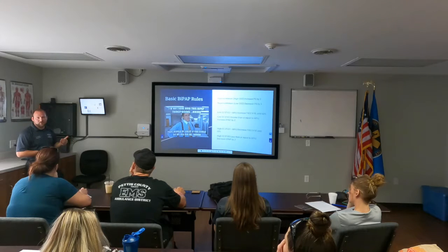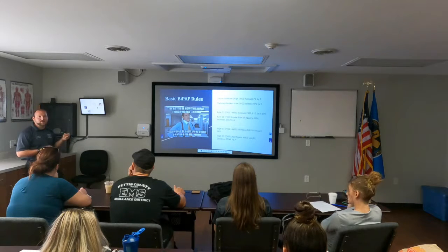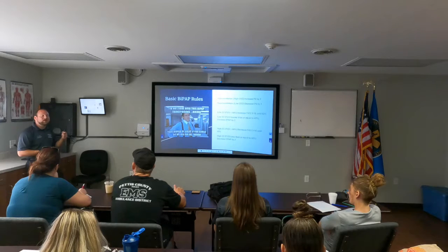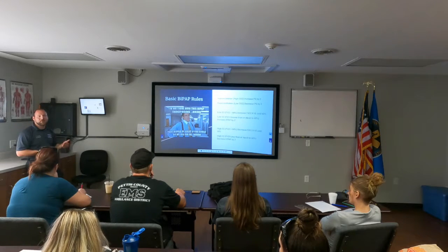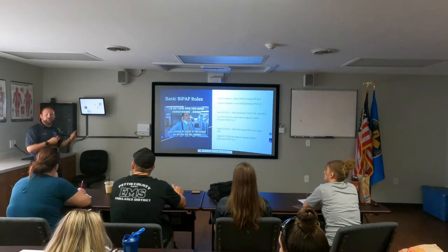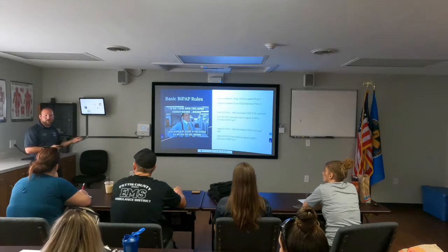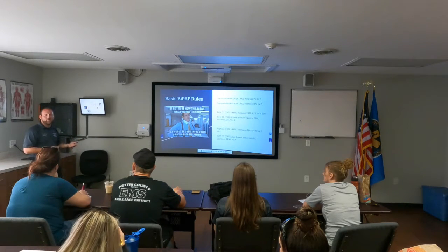Another frustrating thing that people need to realize is that when you make these changes, it's not going to be an instant change for the patient. It's going to take a couple breaths, maybe a couple of minutes, before we see if this is working in the right direction. Give it about 5 minutes, 10 at most, to see if you need to start changing it. Especially if you have somebody who looks like they are air hungry, or someone who looks like they're struggling to breathe, but for some reason they're choosing not to intubate, but they want to give BiPAP a try. Give it a chance, doing your changes to see if that works. If not, start preparing for your intubations.